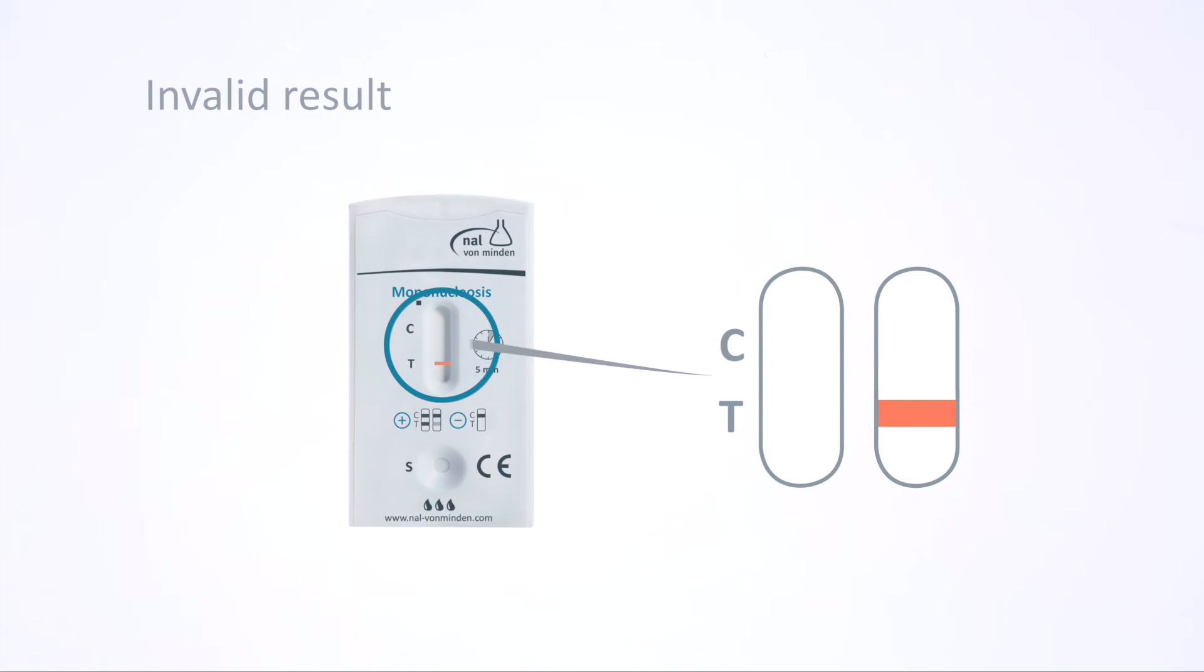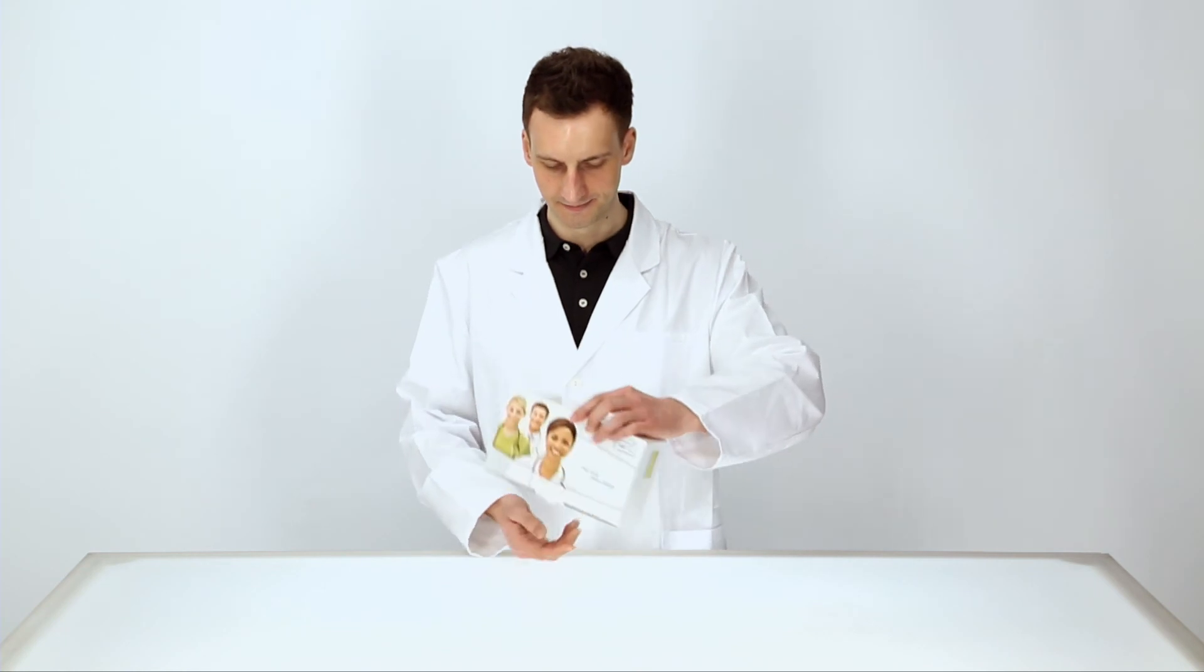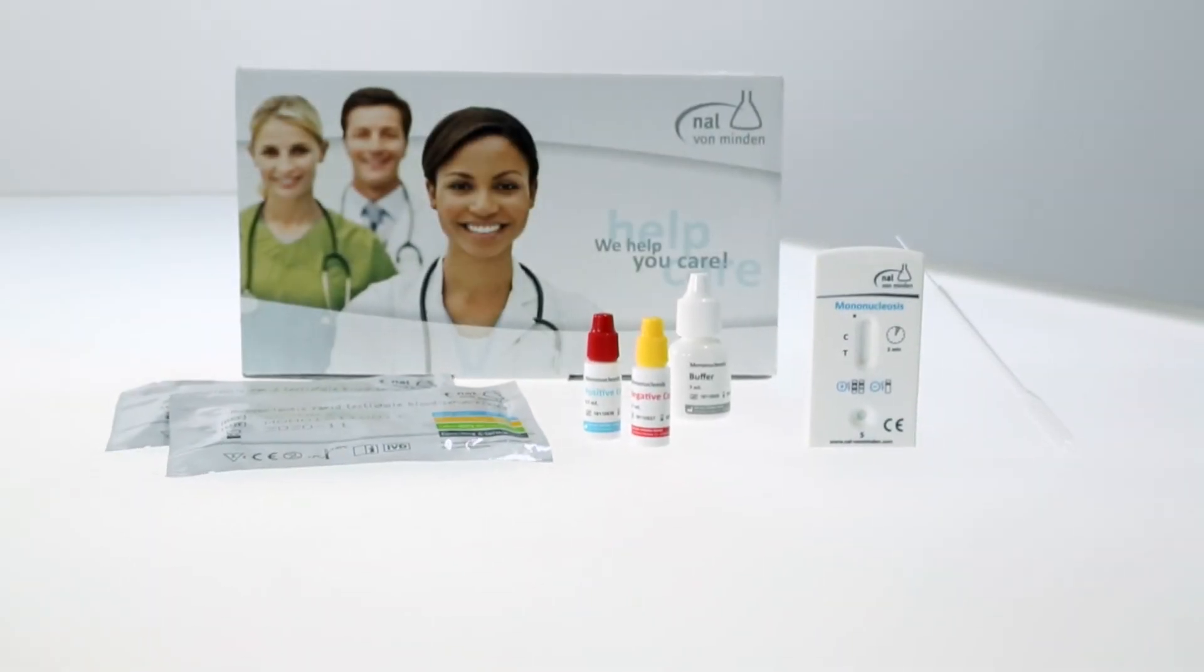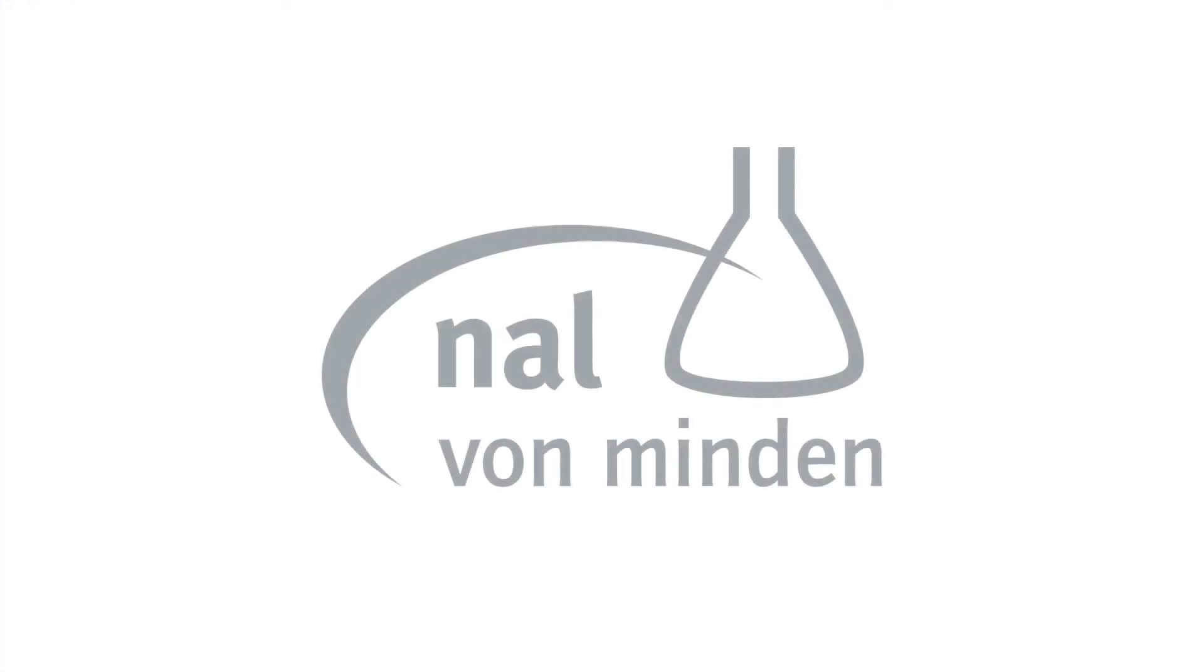If no control line appears, the result is invalid. Repeat the test with a new test device. Thank you.